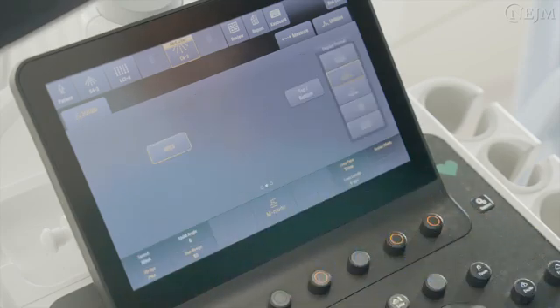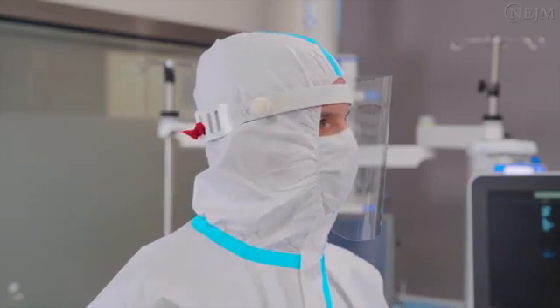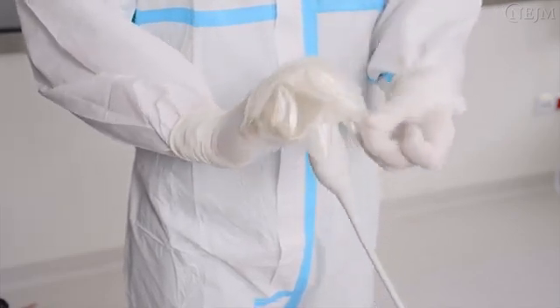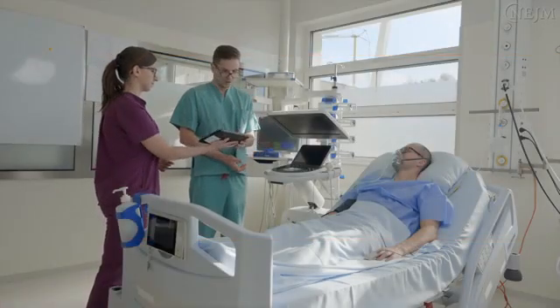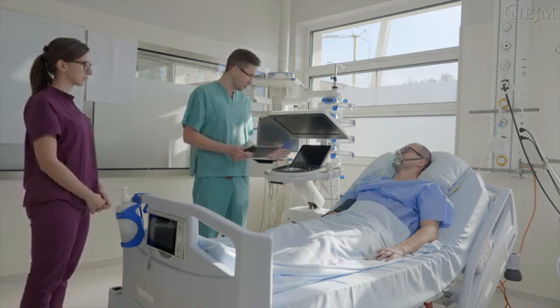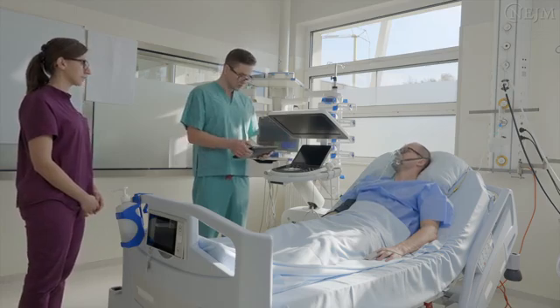In the evaluation of patients with confirmed or suspected highly infectious diseases, personal protective equipment and a probe cover should be used in accordance with your specific institutional procedures. Before you perform the examination, introduce yourself to the patient and verify the patient's identity. Maintain comfortable thermal conditions during the examination by covering the patient or providing a comfortable room temperature.